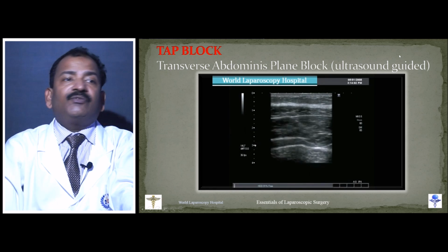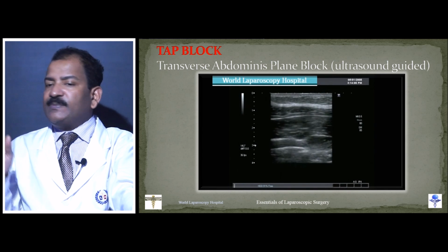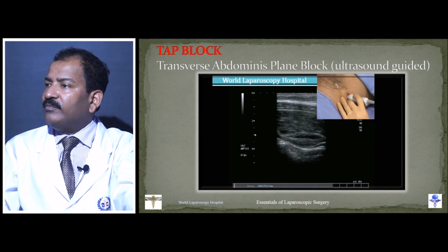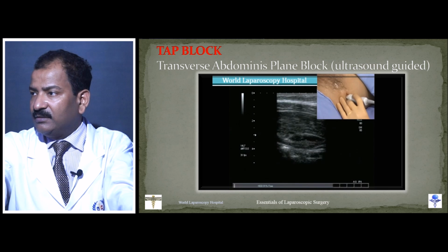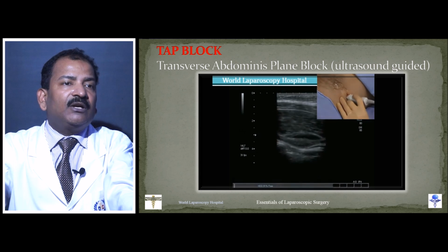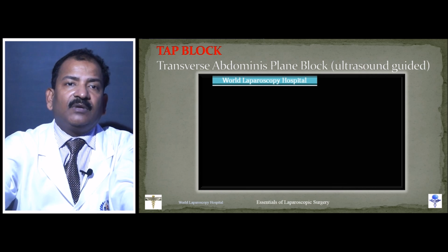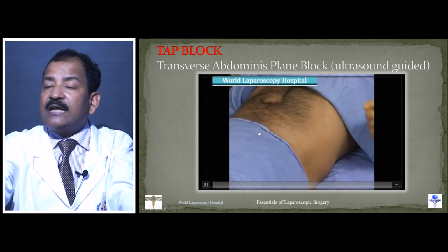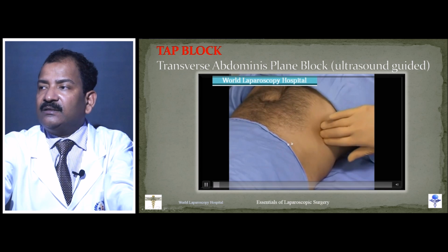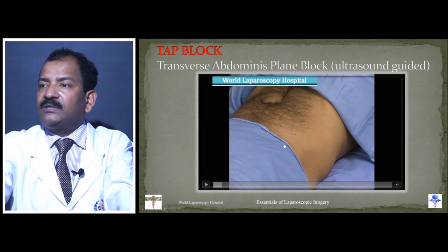Otherwise, if you do not want TAP, then also if you want less post operative pain, you can inject subcutaneous xylocaine before giving incision, because if you inject the xylocaine or lignocaine initially, then the inflammatory chain is not triggered, and by the end inflammation is completely stopped.